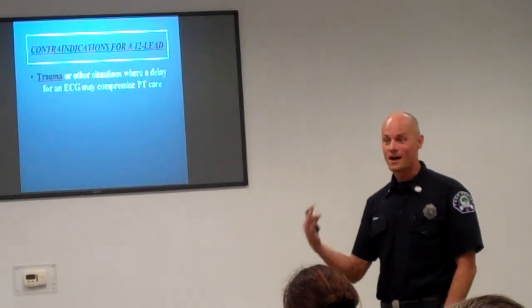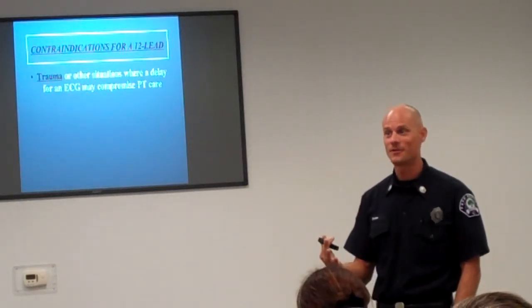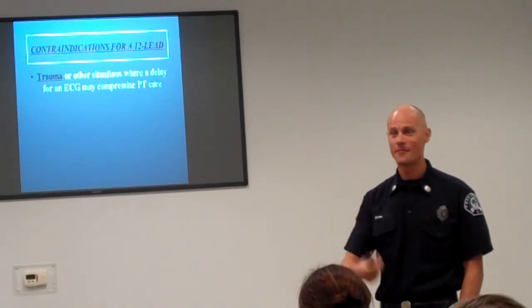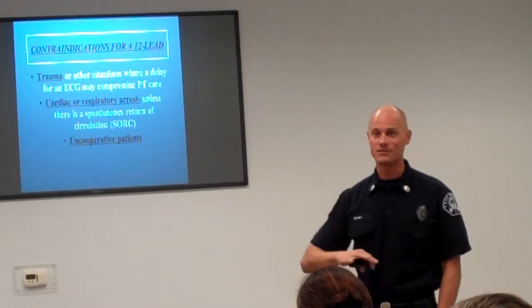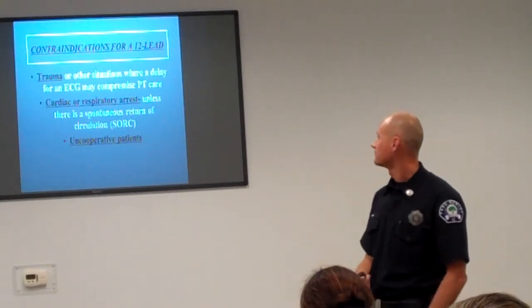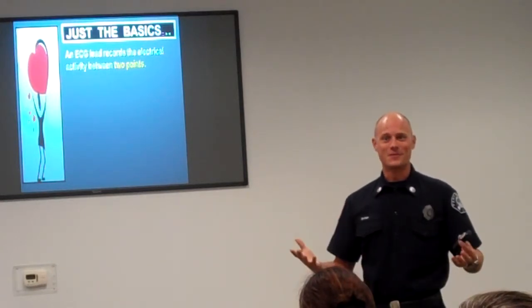Okay. When do we not do a 12 lead? So obviously trauma. There's a couple others. Code. Yeah. Psych cases. Exactly. Psych, uncooperative. If they're not going to let you, don't do it, obviously. Okay. All right. Now let's get into it. So now we know when we're doing it.